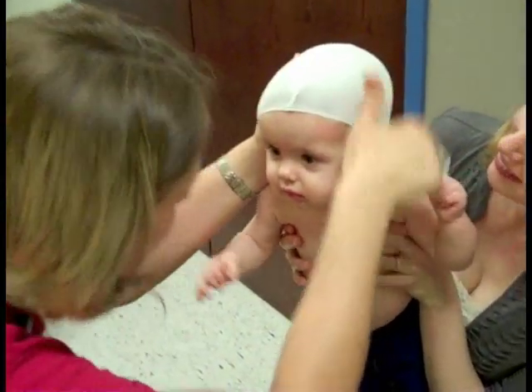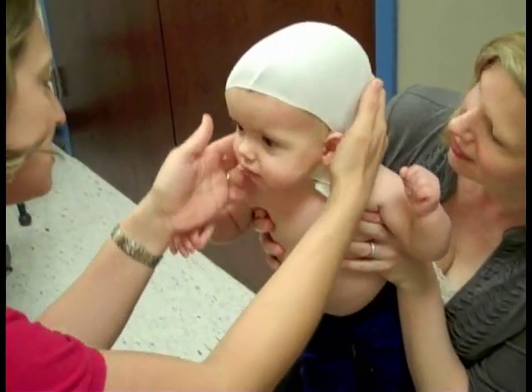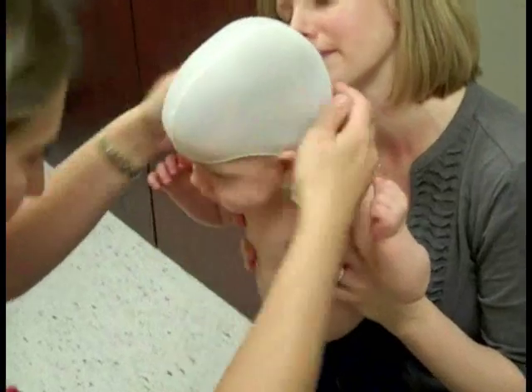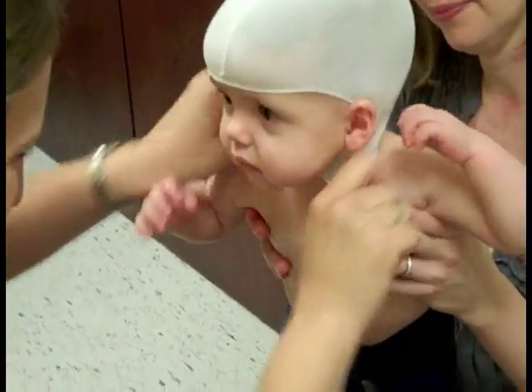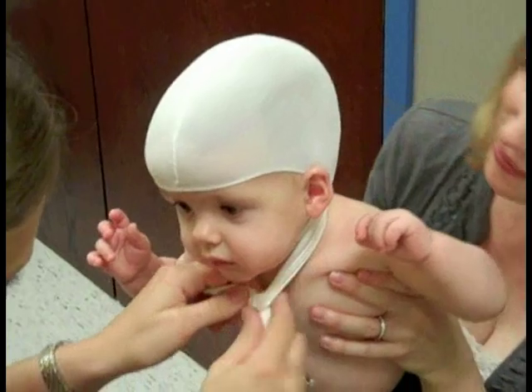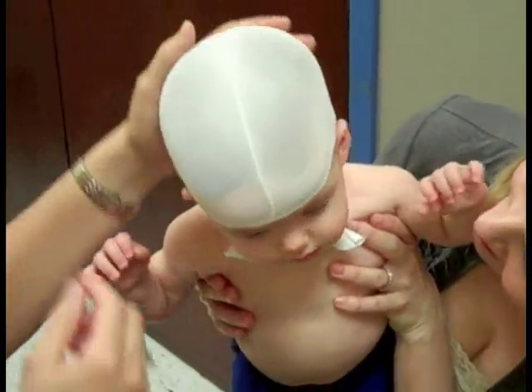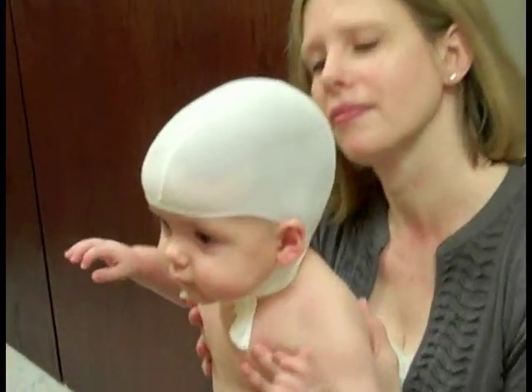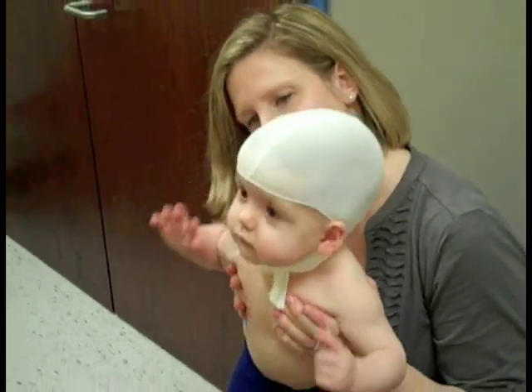You'll be with your child the whole time, and then we'll pick the child up and the image will be completed. The laser takes a quick outside shot of the child's head shape and the data gets fed right to the computer. We'll be able to look at it today and evaluate your child's skull asymmetry and discuss the treatment plan.